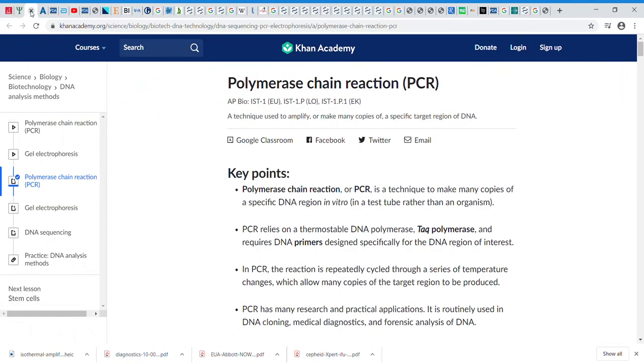So in the past, we talked about the Abbott test. And today we'll talk about a Cepheid test. It's a different test and uses the polymerase chain reaction, which is the classic standard reaction we use to amplify DNA. I'm going to be using the terms DNA and RNA interchangeably. They're not interchangeable. They're similar, not exactly the same, but the general principles are basically applicable. The idea behind a polymerase chain reaction is that you have some DNA, and you want to reproduce and make a whole lot of it so you could do something with it.